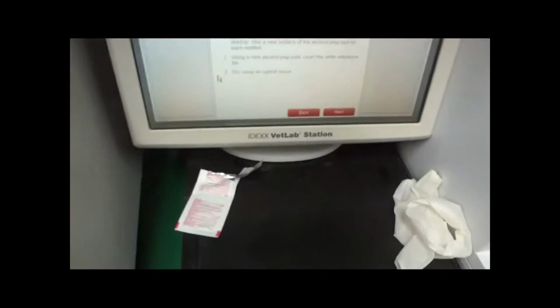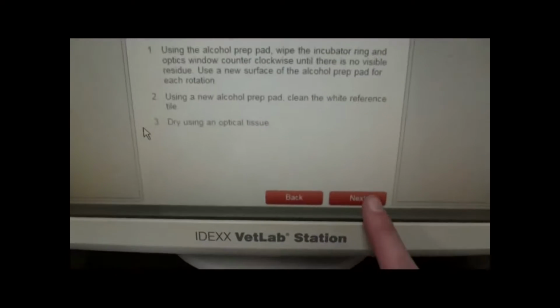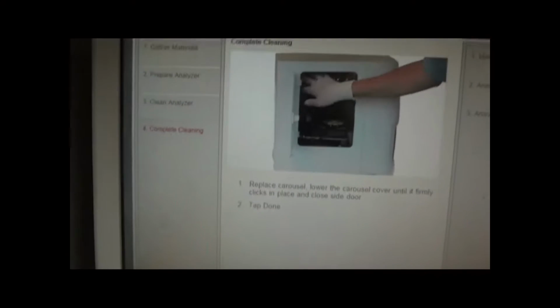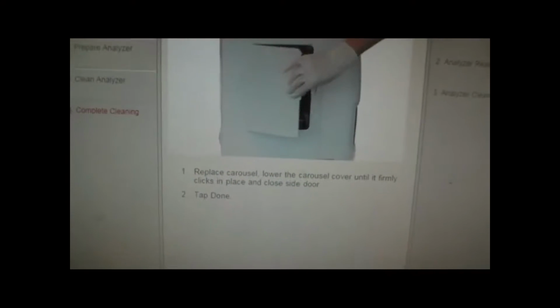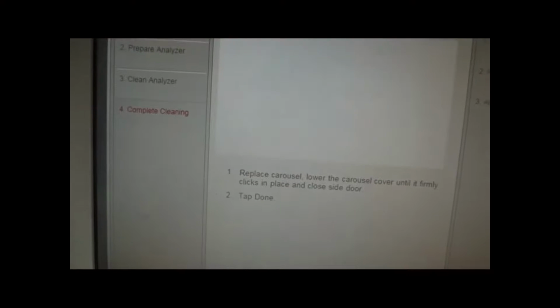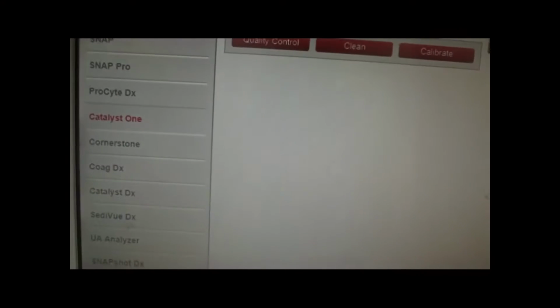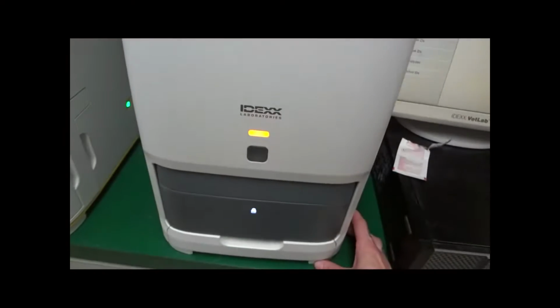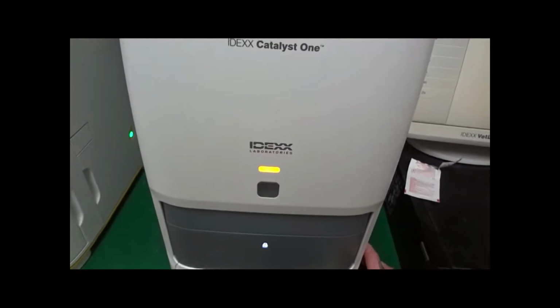Then we will close the top, shut the door, select next. We've placed the carousel back in and done. And as you can hear, the machine kind of does the rest. It calibrates that we've cleaned it.